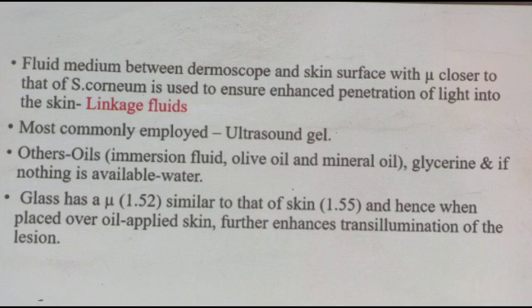The fluid medium between dermoscope and skin surface with the refractive index closer to that of stratum corneum is used to ensure enhanced penetration of light into the skin. These fluids are called linkage fluids. Most commonly employed linkage fluid is ultrasound gel. Others include oils which are immersion fluid, olive oil or mineral oil and glycerin. And if nothing is available, water can also be used.